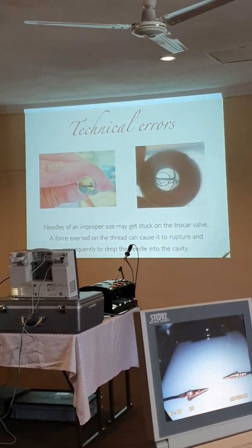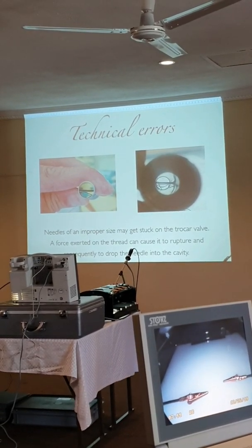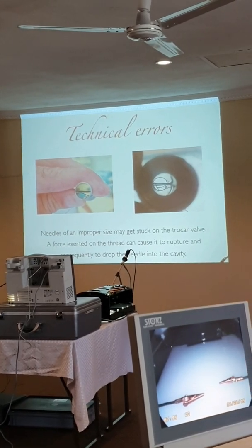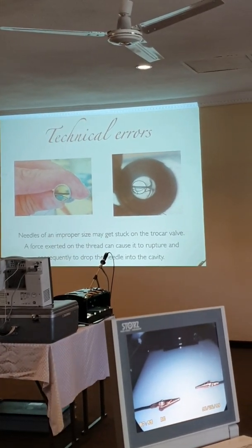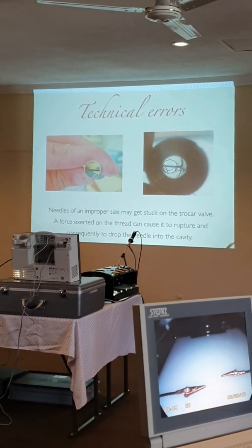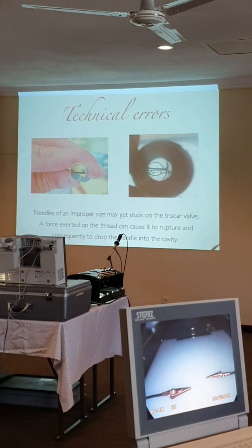And you call the radiology, and come with the radioscopy to look into the cavity for the needle.